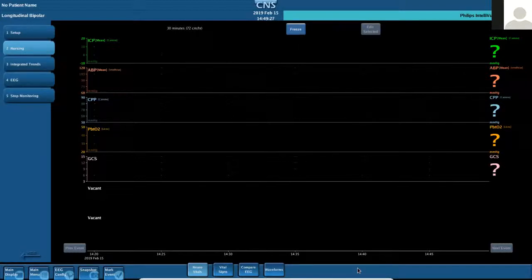Right. And if any of you are big EEG users and you really want to dive into editing the protocol according to EEG electrodes and montages, just please reach out to us, and we can either do a separate webinar for those folks, or we can help you out individually and make sure that you know how to change those more complicated EEG montages.